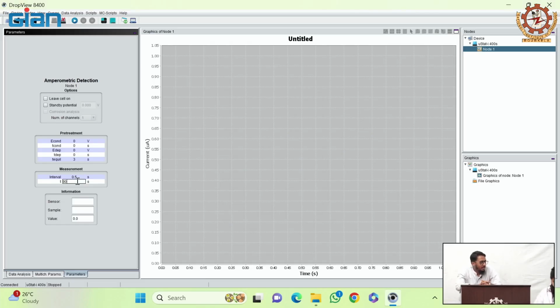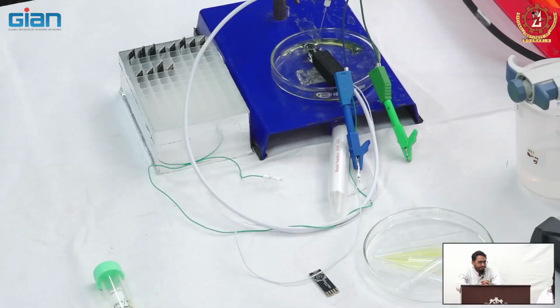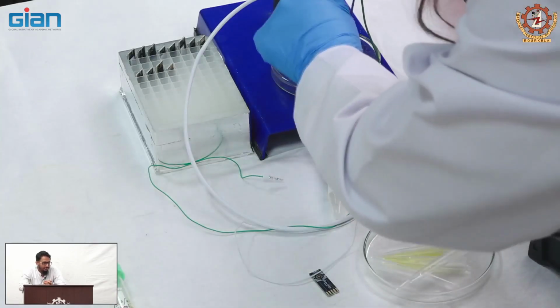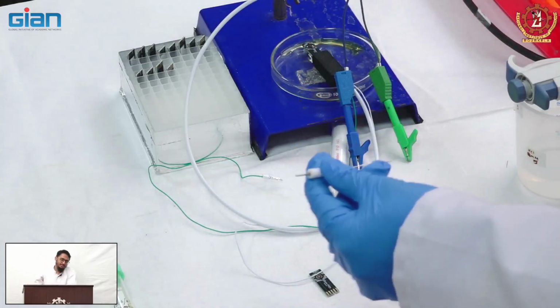Stabilization is complete now. We will wash off the PBS and proceed with calibration. That is the last step, and it will tell us whether our sensor is working or not. It will tell us whether our functionalization was done correctly or not. Visibly it looked correct looking at the CV curves, but here we will get the final verification. And the calibration will also tell us what is the linear range of our sensor.